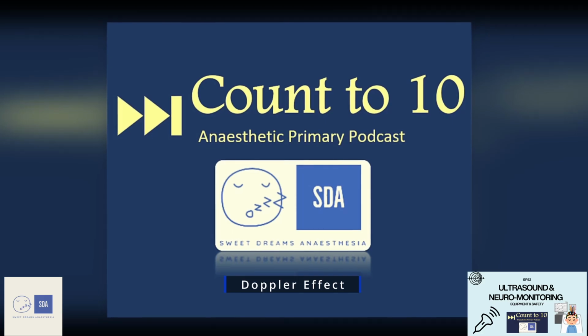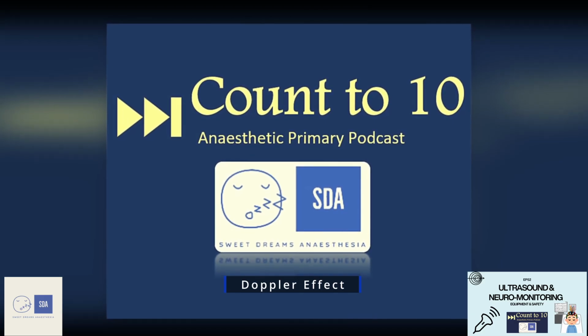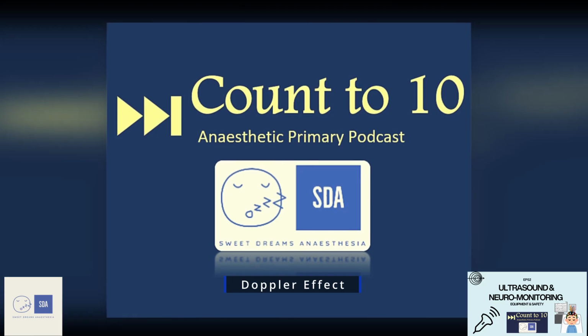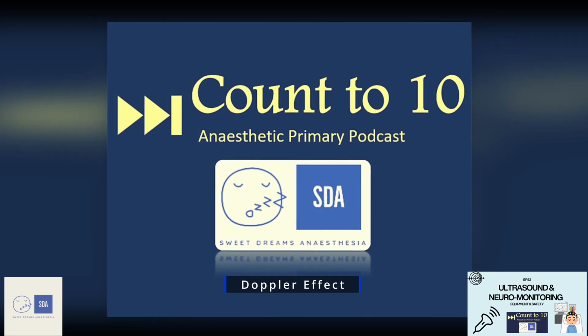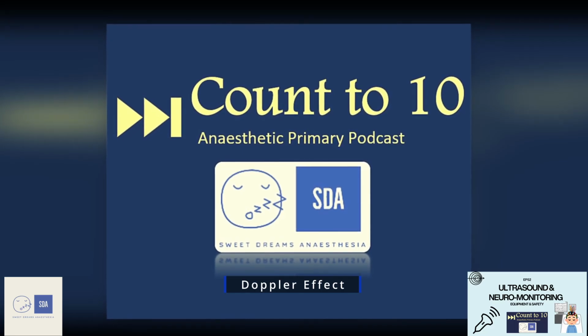Now, to break that definition down, we just have to understand some simple facts, which is that sound travels in a medium at a constant speed. And if we say the velocity is constant, then the Doppler effect only exists because there's a change in either frequency or wavelength.